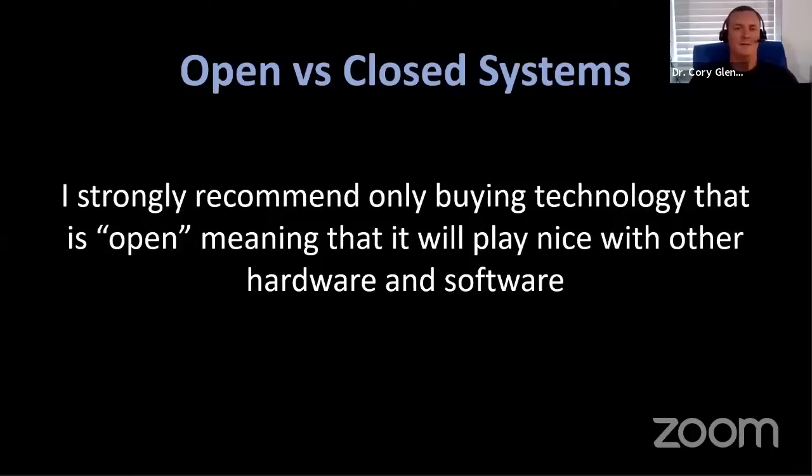I would strongly recommend only buying technology that's open. And what I mean by that is that it plays nice with other systems. For example, in the system I mentioned, I've got to make sure that if I scan with a Carestream scanner, that gives me access to my STLs that I can pull into Blue Sky, which is an open software, which I can then export to Hyperdent, which is an open source CAM, into an open source mill, right? Things like Cerec, for example, would be considered a closed system.